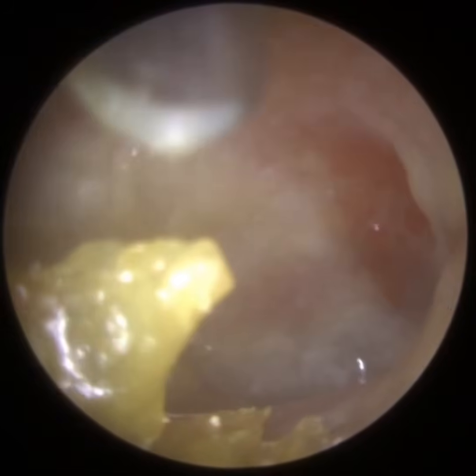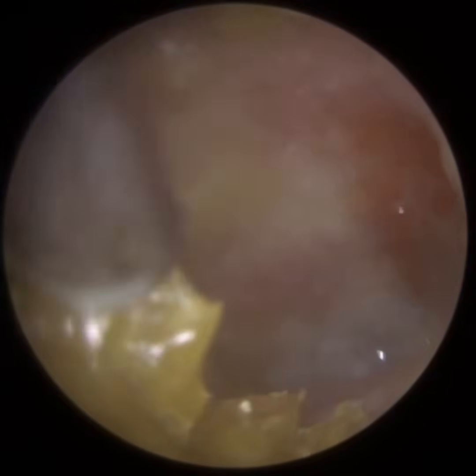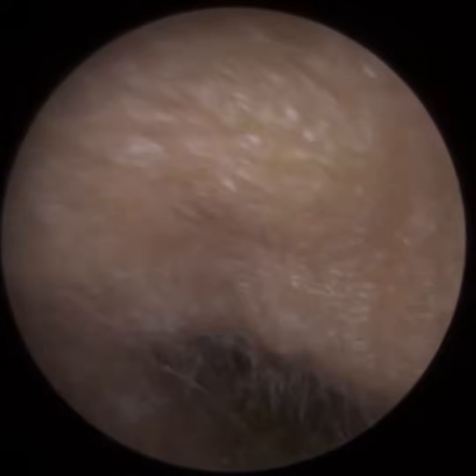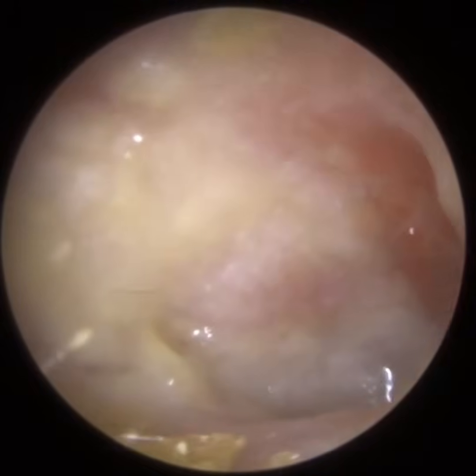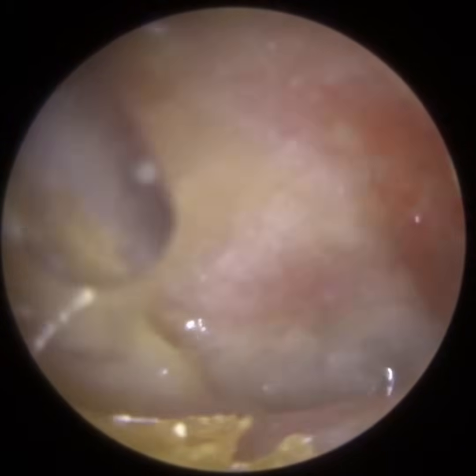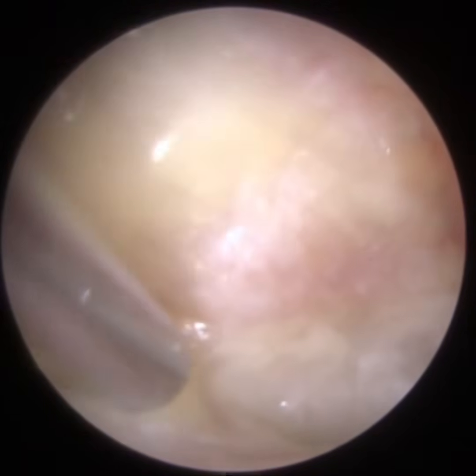So this is more damp, dead skin on the anterior canal wall. It's quite medial, but I was peeling it away more laterally. The umbo, the centre part of the hammer bone. The hammer bone is the first bone in the middle ear. The umbo is now visible. You can see it there in the middle of the screen.